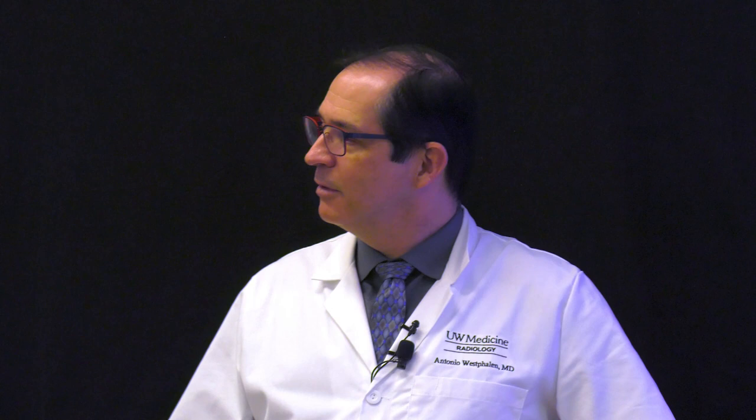Now, again, there are new techniques coming. There are new things that are being developed, and I do think the future will look different. When they first started with PSMA, I was thinking, oh wow, all they did is take PSMA and link it to a radiopharmaceutical they can actually image. Can't we just link it to gadolinium and image with MR and see what happens?